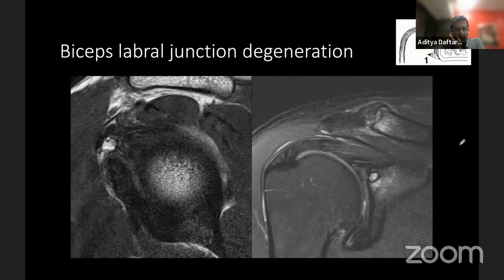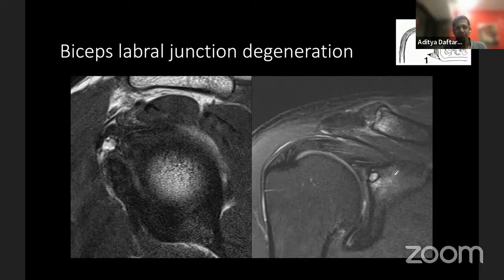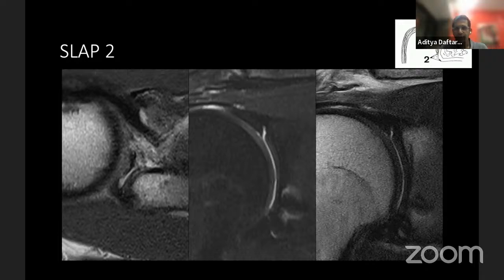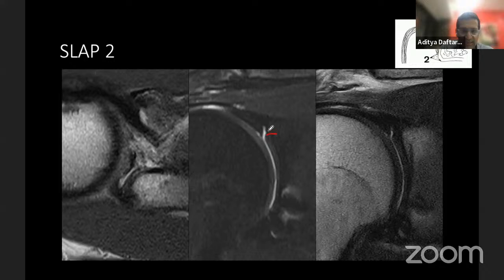Here's another example where you can see degeneration at the biceps labral junction along with development of intraosseous cystic change in the superior glenoid. Here's someone with a more discrete SLAP 2 lesion — comparing the labrum, you can see it has come off and the cartilage stops at this point. The labral cleft extends above the level of the cartilage, and therefore this is a SLAP 2 lesion.